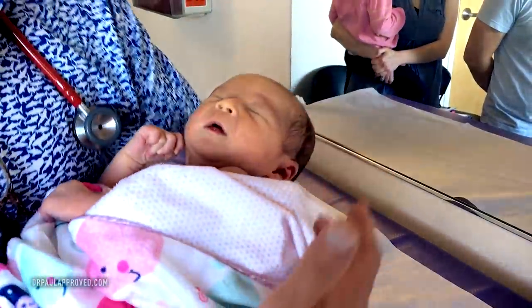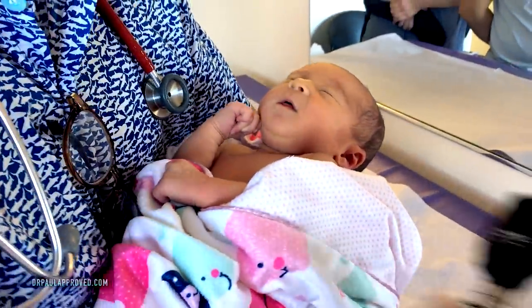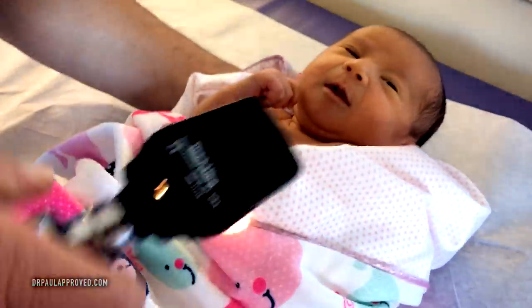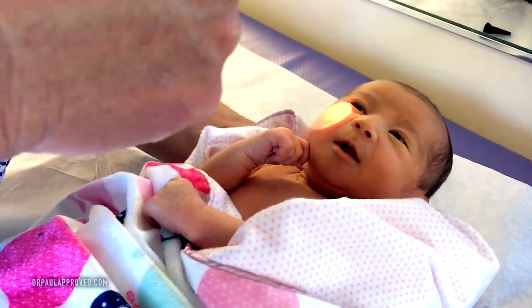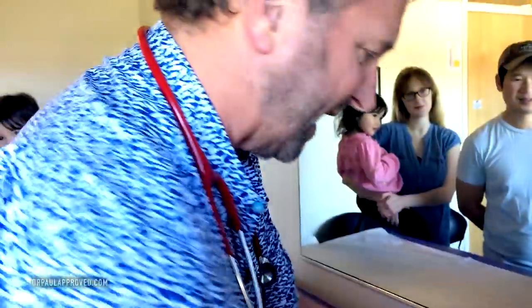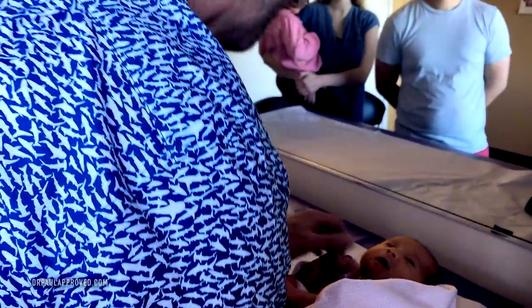Now you can open your eyes, and we look at the whites of the eyes if we get a chance. She likes to just open one — the left eye opens easier than the right. So I'm going to do a red reflex. You get your ophthalmoscope and you look right at the pupil and look for a flash of red. You can't see that on the camera, but I saw it. That's a normal red reflex.